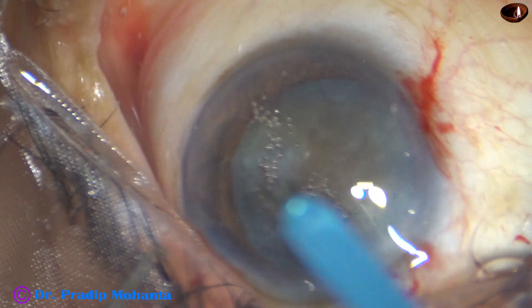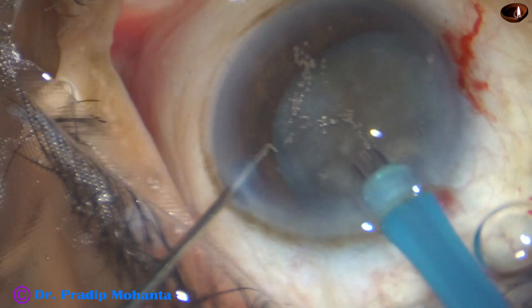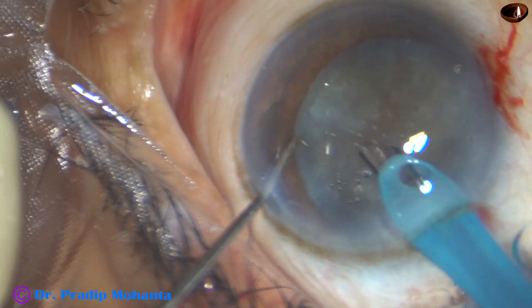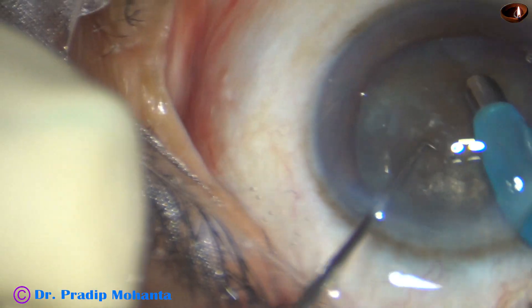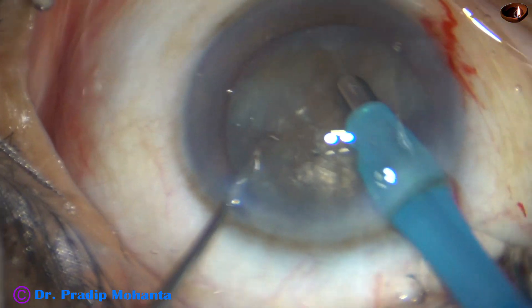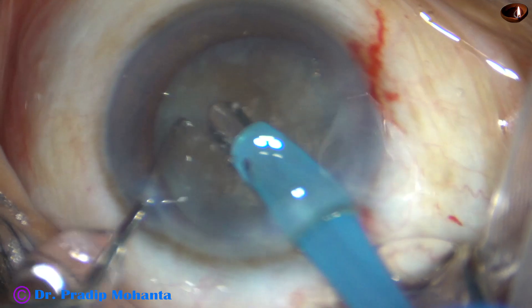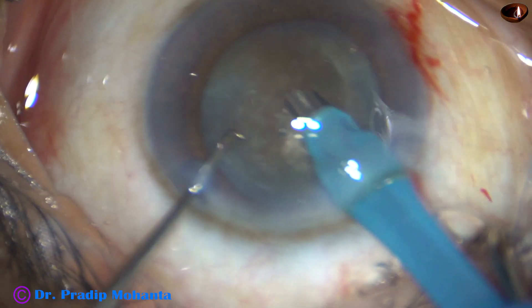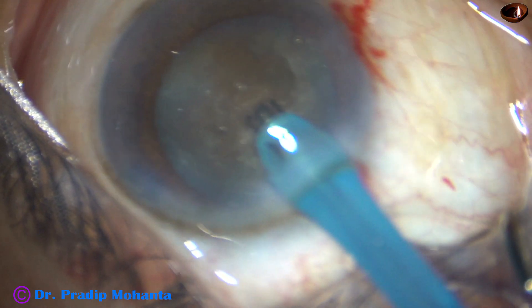The tip of the phaco handpiece is introduced into the anterior chamber. Some superficial cortical lens matter is removed with bevel down. Now the handpiece is turned — bevel is made up towards the cornea. In this case, I am going to show the submarine chop technique.